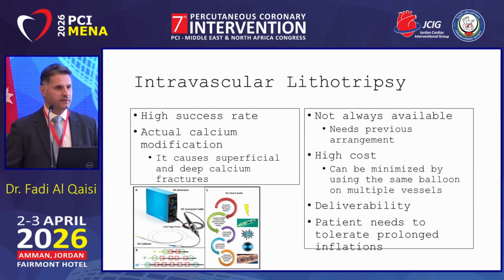And we have the very, very, very nice intravascular lithotripsy. This is a wonderful invention, high success rate, it has actual calcium modification. It doesn't need any special skills, just plug in, deliver, and it cracks the calcium. Unfortunately, again, not always available. It has a high cost, very high cost, but the nice thing is if you can treat more than one artery you can use the same balloon.